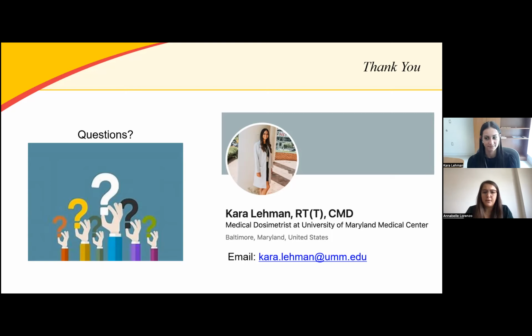Do you know how the physicians sign off on the breath hold review daily? Yeah, if I'm understanding that question correctly, we just have our physicians approve our images at the end of every day. And then of course we don't treat them the next day until the physician has approved it from the day before. Unless it's their first day of treatment, then we'll have the physician come and make sure that they look at the images before we start treatment.